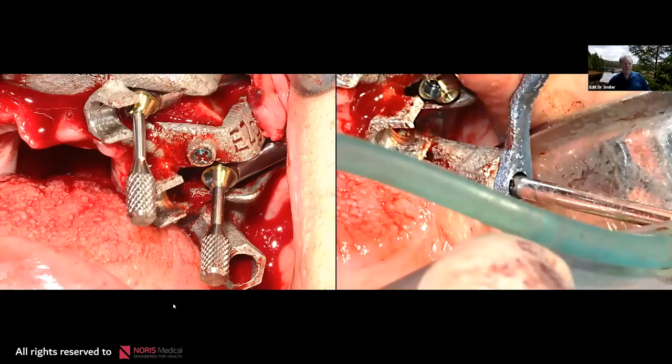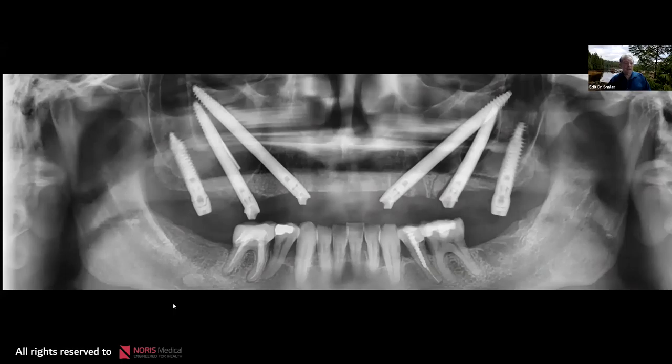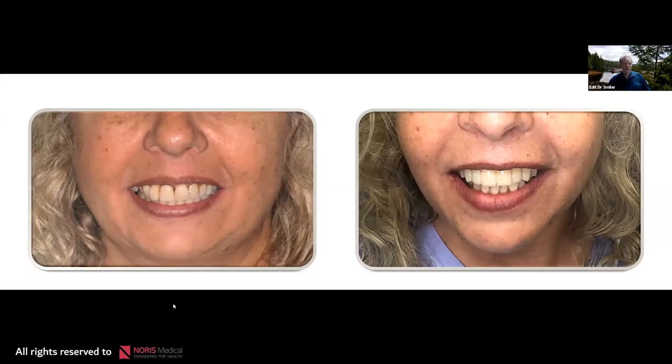Multi-unit abutments are placed, and now we're ready for the pterygoid. Sequential drilling through the guide, lots of water irrigation, and the implant torques down where we want it on the crest of the ridge. After surgery: pterygoid, two zygomas on each side, and pterygoid on the other — each with multi-unit abutments. In the afternoon, the patient left after prosthetic reconstruction with a fixed temporary PMMA case while healing proceeds. She came in with a failing maxillary dentition and left with a fixed dentition.